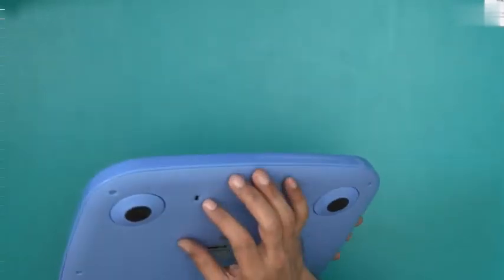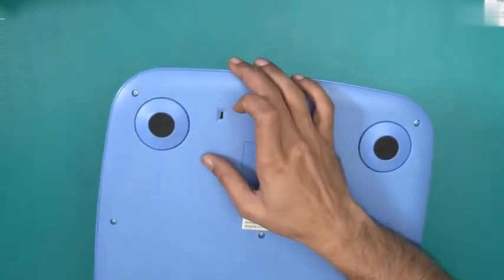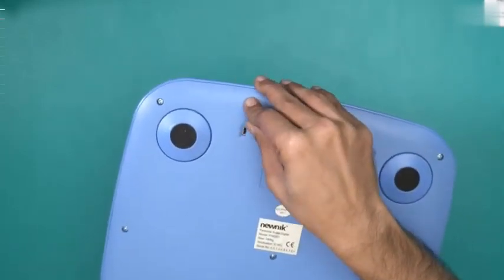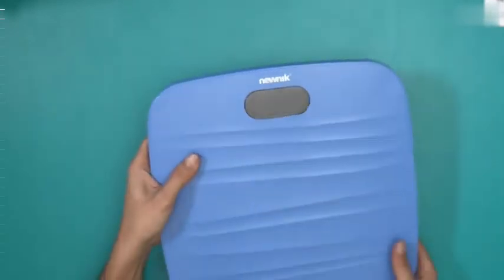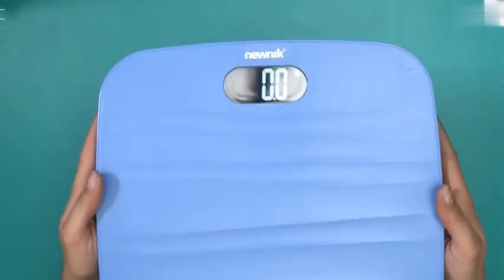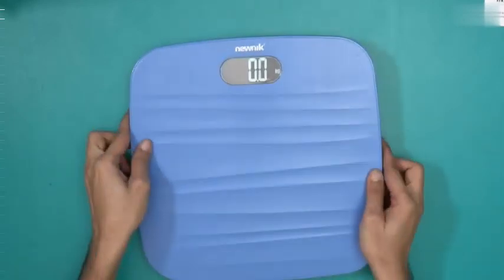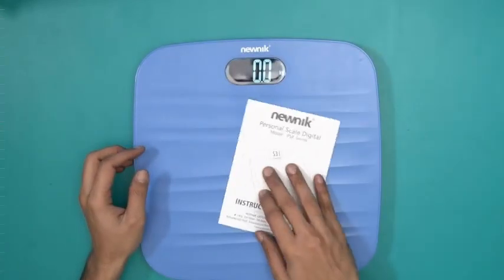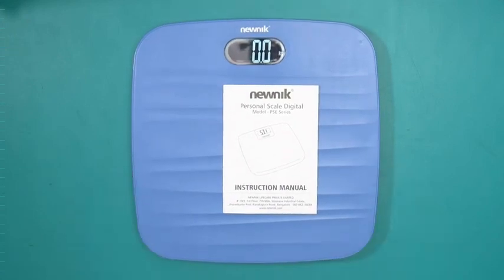It stopped working for some reason — there are only two units here: kg and pounds, and it stops at stone as well. Let me just put it at pounds and see if this works. It's working now and it's giving the unit in pounds. Put it back in kilos. So this is what you'll find inside the box containing the Newnik PSE201 Personal Scale Digital.